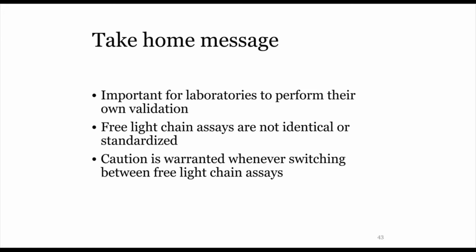And so we do strongly recommend that laboratories do their own thorough evaluations, not just ones that are required from a CLIA point of view, but clinical evaluations on real patients to make sure that what they're getting, both for the quantitation and the ratios, are similar.